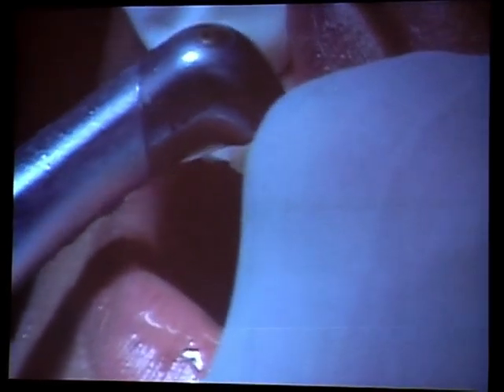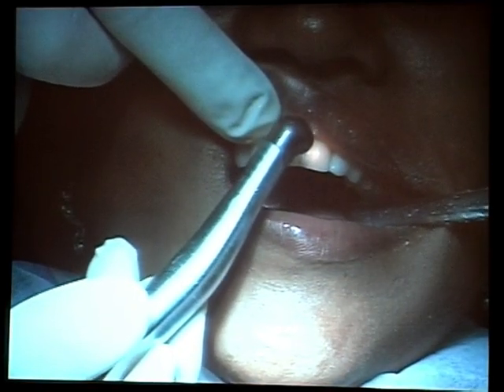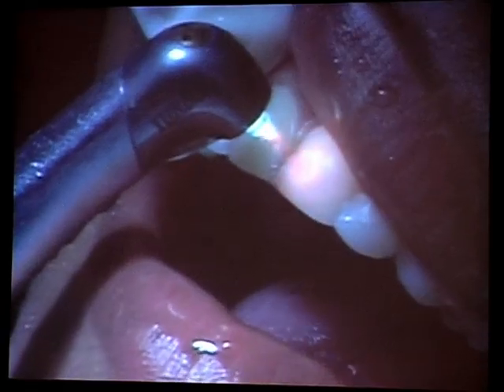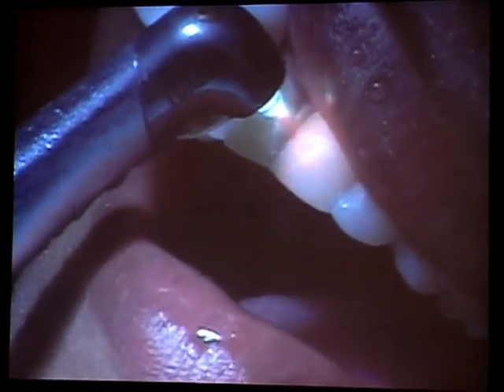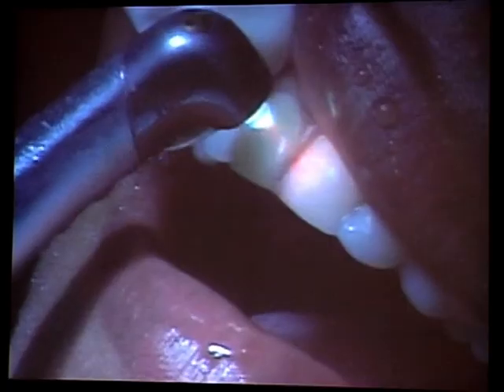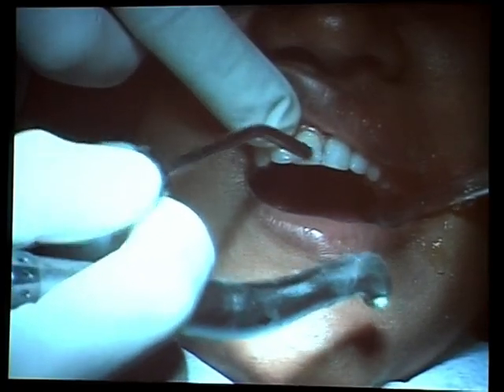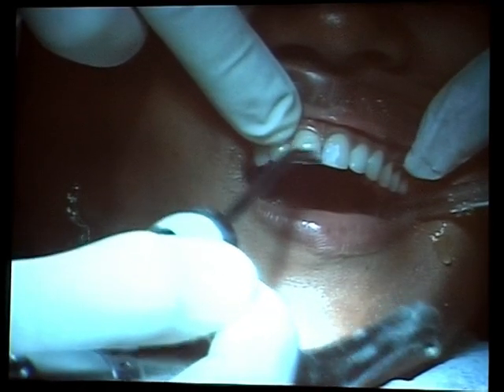And because there's so little water in the filling, it takes much longer to remove the filling than to prepare the cavity. Now you can see a pitted appearance in the tooth. It's not going to be an aerator-like cut of the tooth because it's going to be a pitted appearance. So if you're doing a composite laminate, this is fine. But if you're doing a ceramic laminate, then you will have to finish this with a diamond finishing burr.